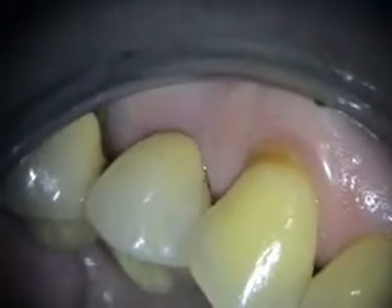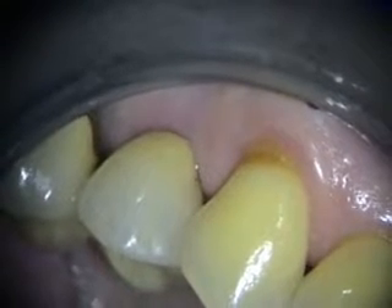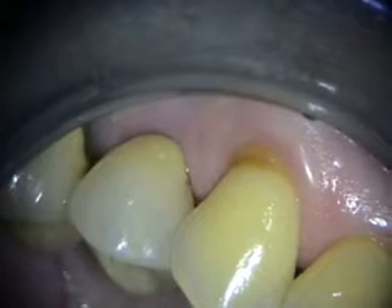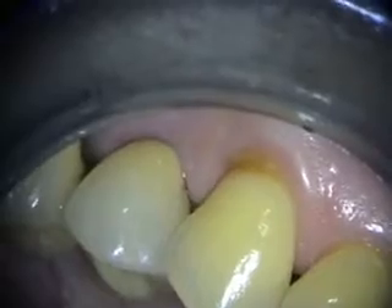This is the three-month healing of the Geristhor here on the mesial of number five. She still has like a five millimeter probing depth and a little bleeding on probing. We'll take a look at the x-ray next, and our goal now is just to try to maintain this.